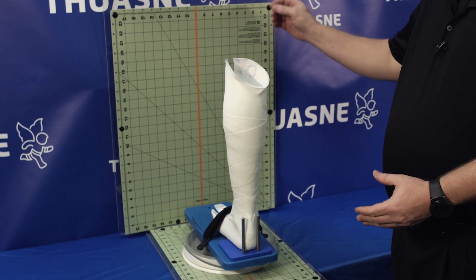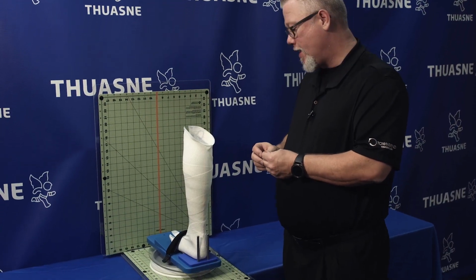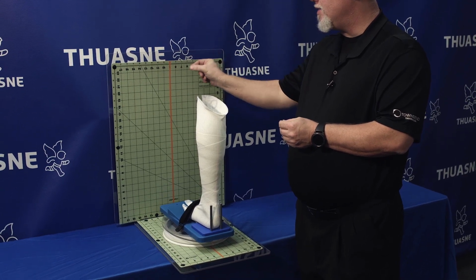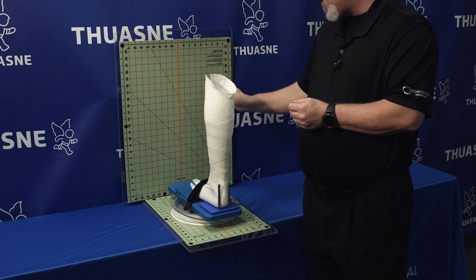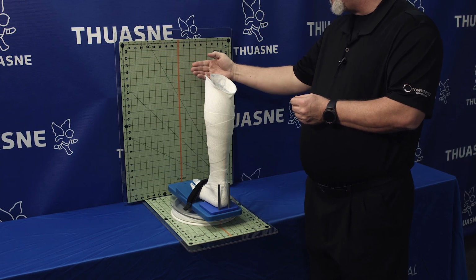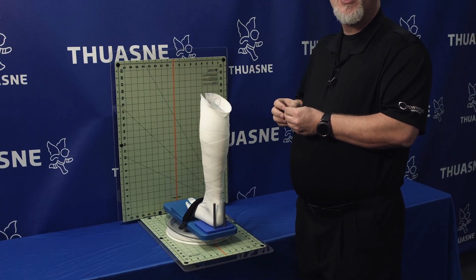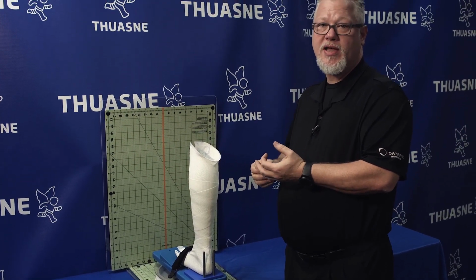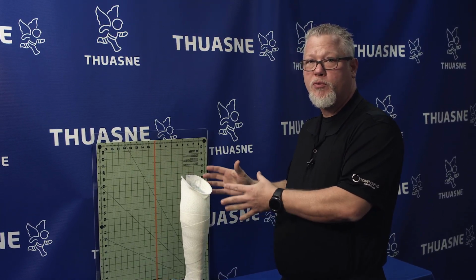This is a grid board that Townsend Design created specifically for the Custom Spiral AFO. We do have a center line, which will give us a tibia vertical line, and we also have not only the grids on posterior, but we have the grids at the foot plate as well. This will help us to determine deviations in the cast for a good cast or a failed cast, which would be a bad cast. And we're going to show you examples of proper aligned cast, and we're also going to show you examples of a poorly aligned cast.